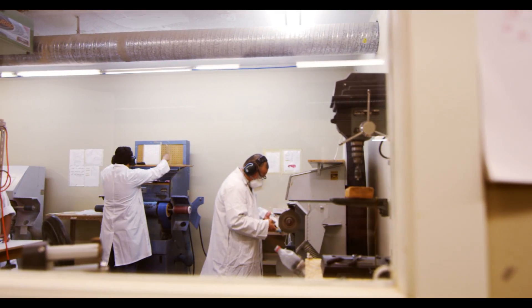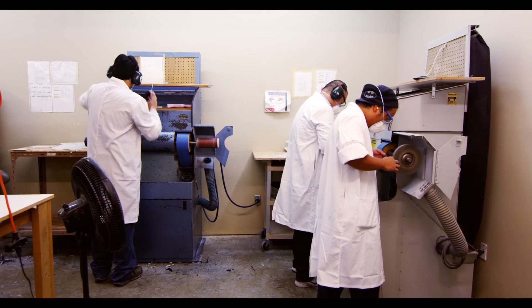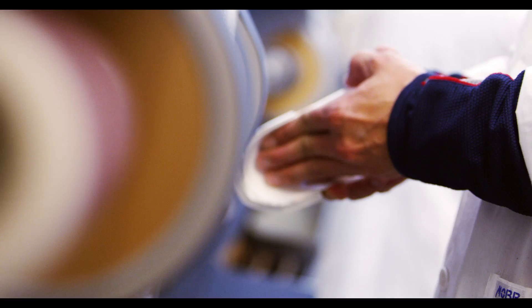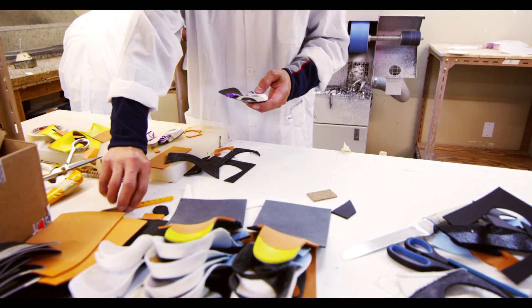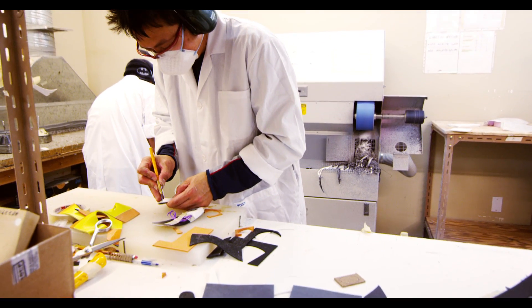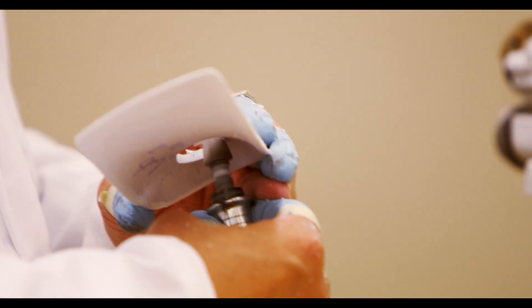The excess material is then trimmed. Here in the grinding section is where the orthotic really begins to take shape. The vacuum formed or direct milled orthotics are ground down to their final width and depth so that they will fit into your shoes. Additional support or cushioning components may be added at this time if your pedorthist has requested them.